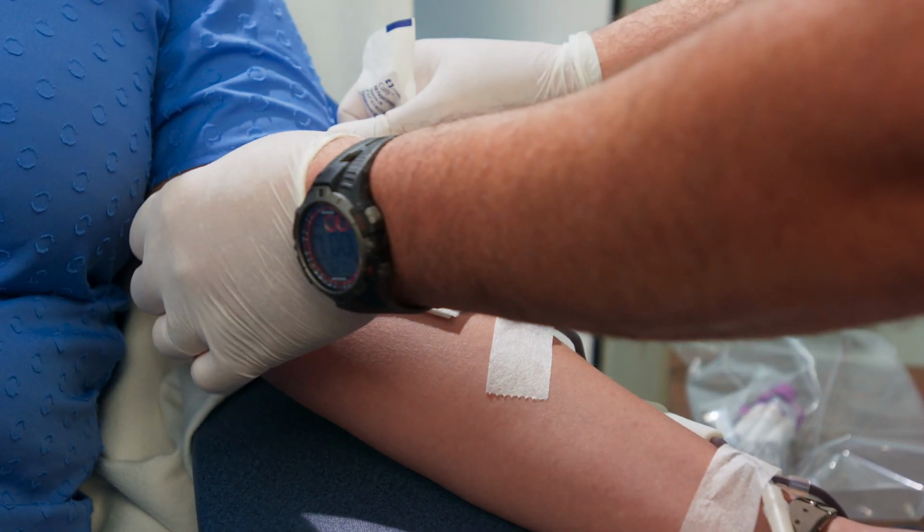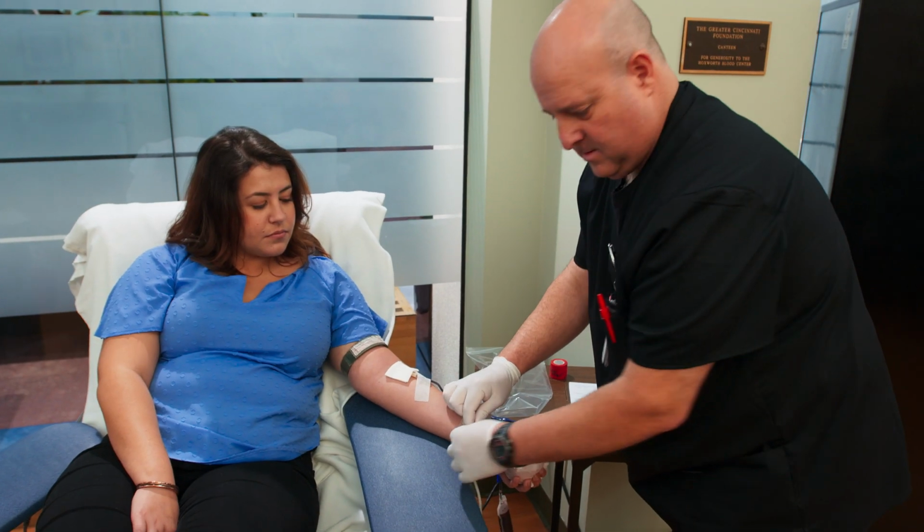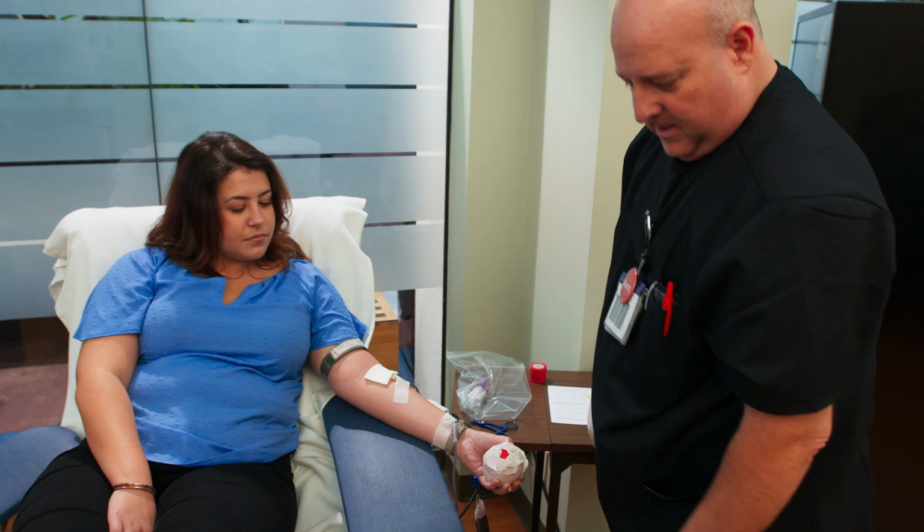Cover the needle up for you. Loosen the tourniquet up. All right, and you're going.